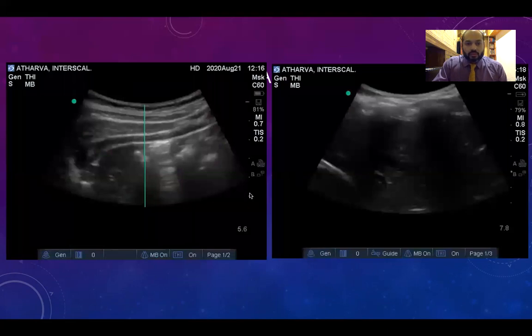So this patient was done about 2 days ago. This patient was a young patient posted for arthroscopy surgery. And this patient was given general anesthesia along with interscalene block, 0.2% ropivacaine 15 ml with 30 micrograms of clonidine.